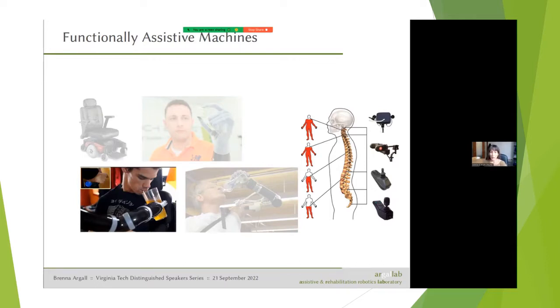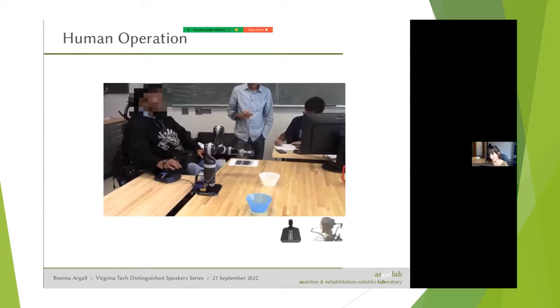And of course, what happens with robotic arms is that you end up using modal control if you're going to do direct teleoperation, where you have to partition the control space so that you're only covering a subset at a time. So you're maybe controlling an XY, and you have to press a button, you switch control modes, and then you maybe are able to control in rotation, press a button, you can maybe control in the third dimension of rotation like that. Here's an example of what that looks like.